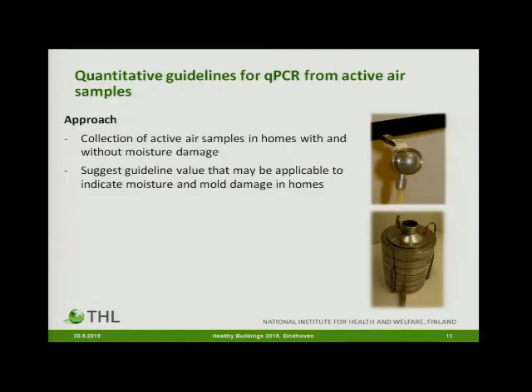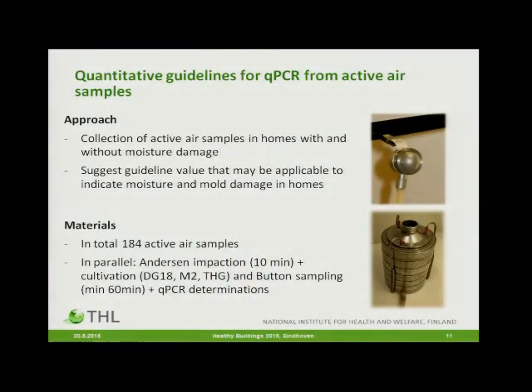Okay, to finish this off, I'll just jump very quickly: we did a similar thing with air samples, and it was so much easier because we didn't need to use cultivation to relate to, because it's obviously arguable. We had moisture damaged homes where we know from inspections there is a moisture problem, and we have reference homes, and we collected air samples there in parallel, again with cultivation, Andersen impaction, like traditional methods, and then with button inhalable aerosol sampling for at least 60 minutes, going from 1 to 2 hours. That is already an advantage in our experience over a short-term 10-minute air sample.